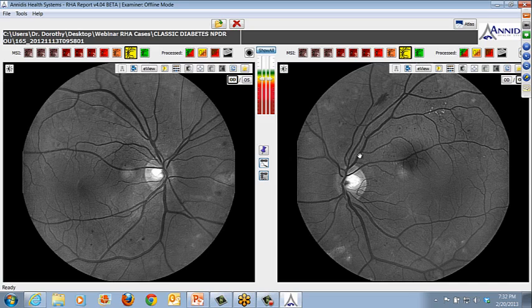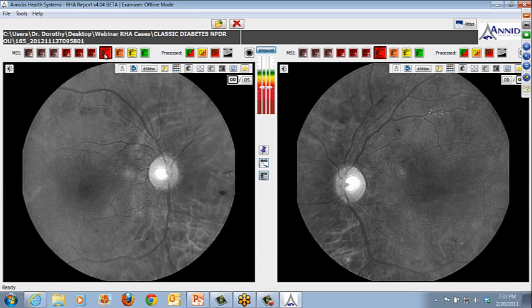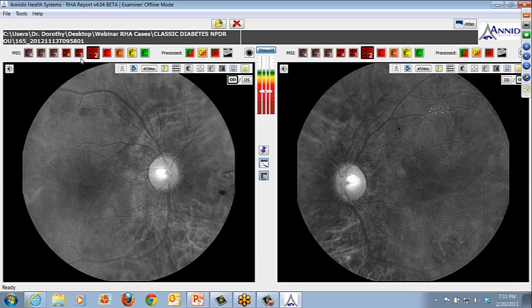and also see fine blot hemes in about 3 quadrants here, and we divide this up, just about all 4 quadrants here, also a flame hemorrhage as you would expect. And you know where those are because as you go down closer to the RPE, those hemorrhages will fade. The exudates are more optically dense, and so those will persist through the images.